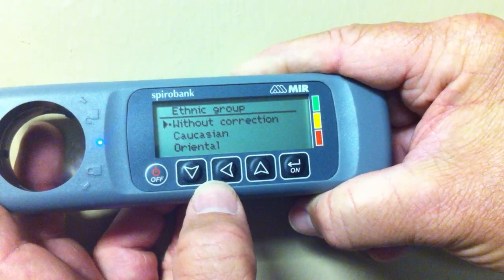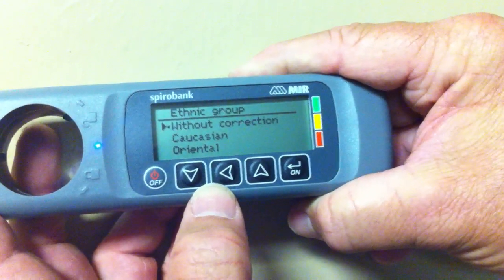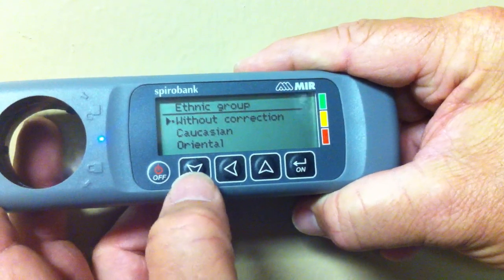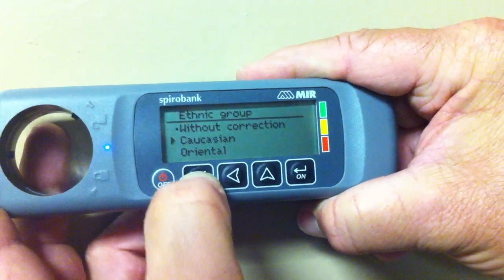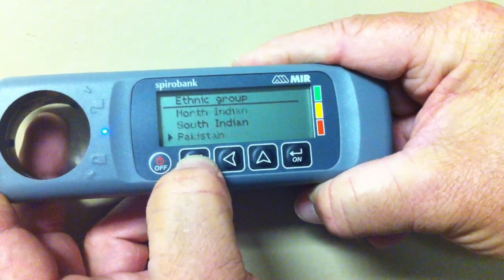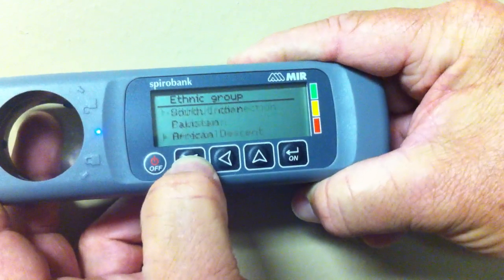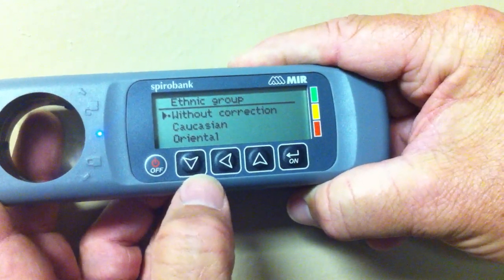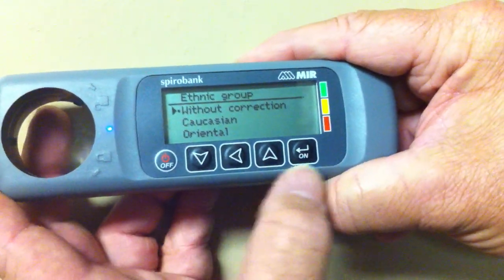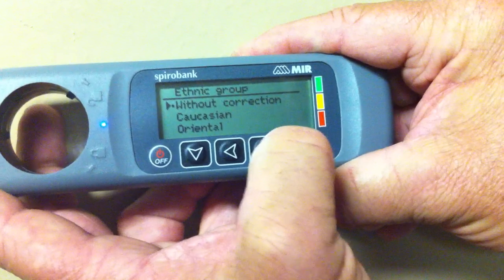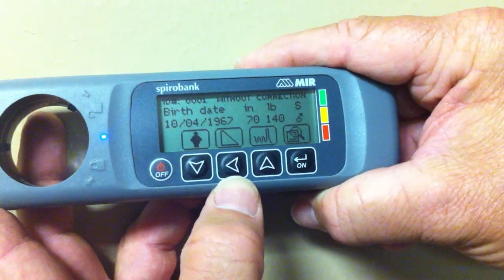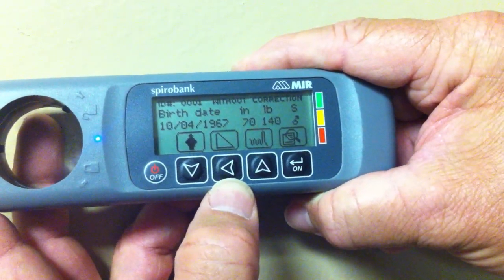Choose the ethnic group of the patient. If the patient is Spanish or Hispanic, you can choose that option. Scroll all the way down without correction to make your selection, then hit the on button. Use the ramp button to begin your test.